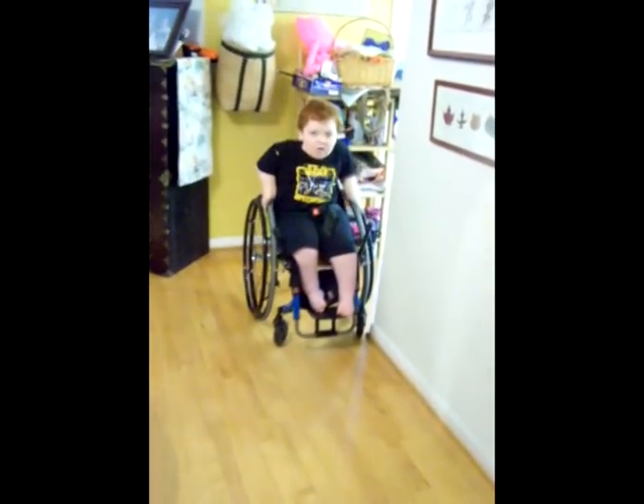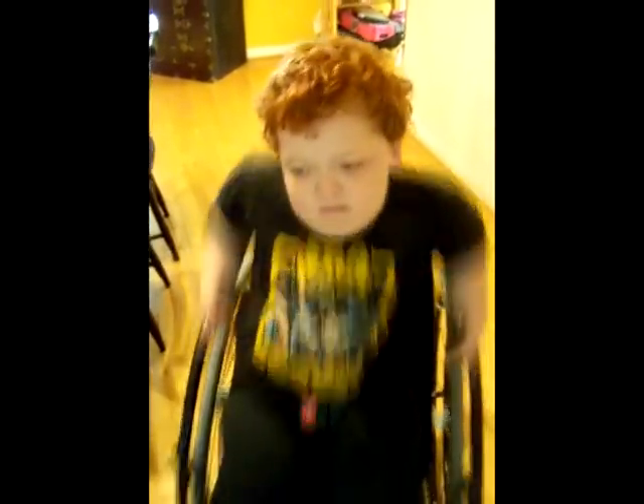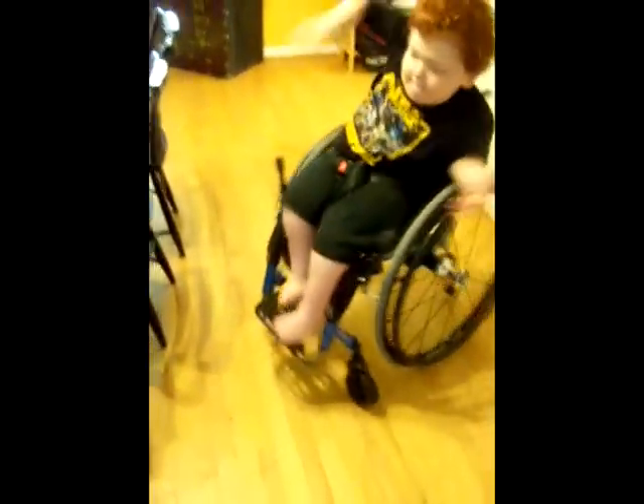You can't stop? Come towards me, please. And now stop before you get to me. Can you stop the chair? Back up a little bit and turn around and go back through the door again, please. Lean side, lean side. You're going to turn by using the wall. Can you try not to use the walls and stuff, just use the hand rims and the wheels?